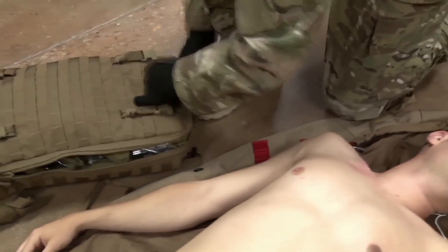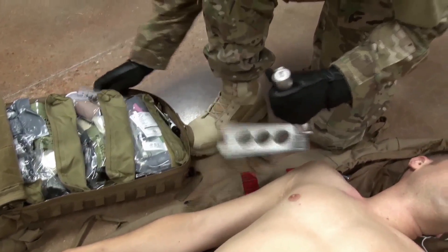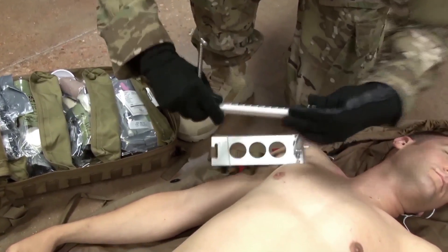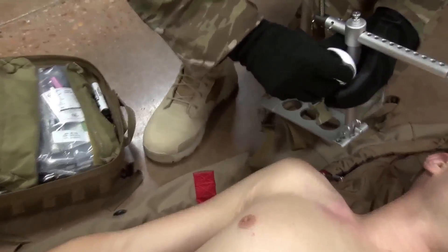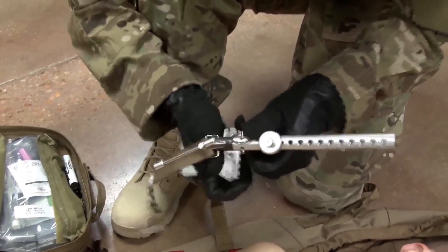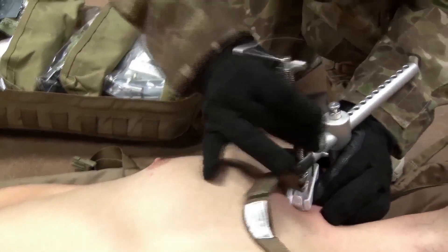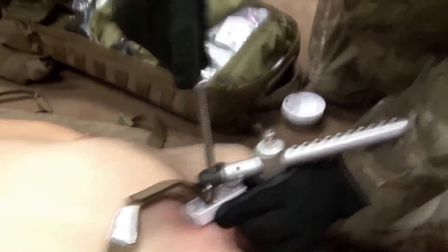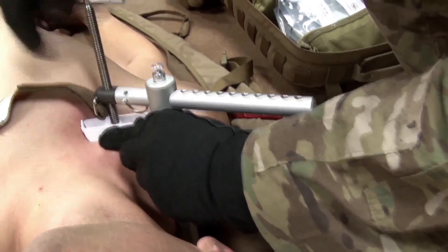To apply the Croc to the axilla area over the shoulder, locate the deltopectoral groove on the injured side. Press one of the release tabs to remove the large disc head to reveal the square pressure disc. Position the base plate under the patient beneath the scapula. Ensure the vertical arm is in contact with the patient on the wounded side in close proximity to the wound location. Ensure the pressure disc parallels the clavicle at the proper angle.